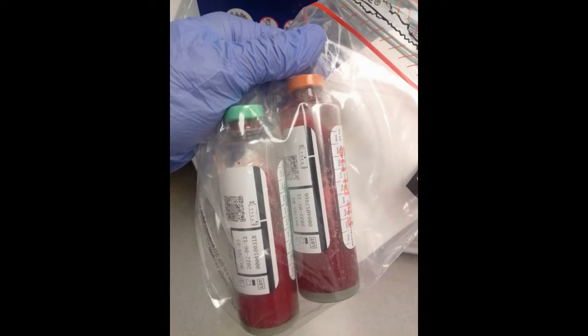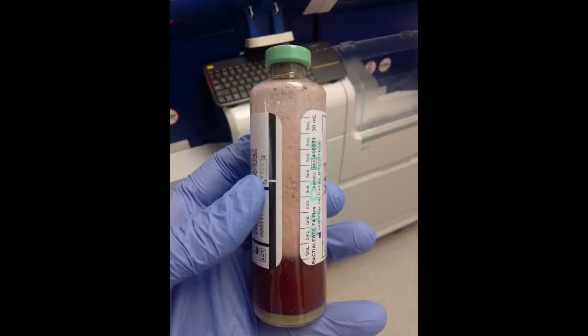I think this is the most important culture that we do in the lab. What do you think? So blood culture consists of two bottles, an anaerobic bottle and an aerobic bottle, and that consists of the set. And normally you draw two sets of blood 15 minutes apart from two different sites. So in total, we'll have 4 bottles in the lab that we incubate.